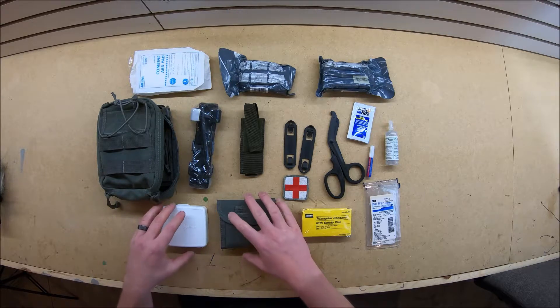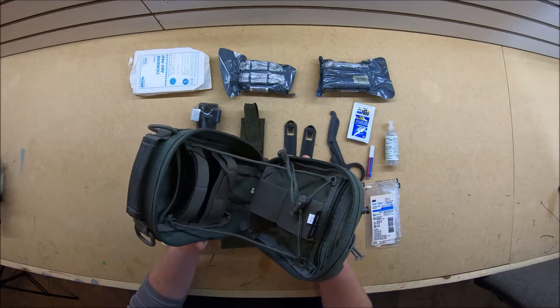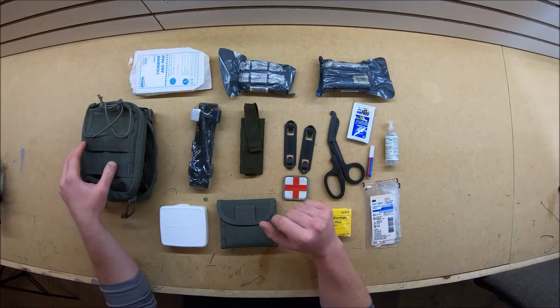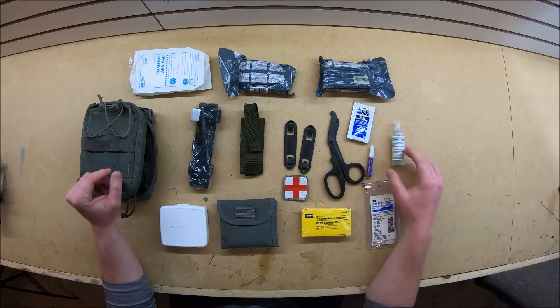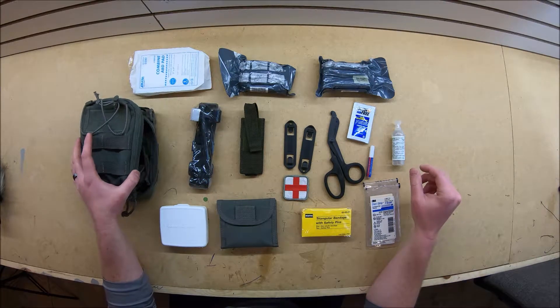We're going to start out here with this Maxpedition pouch. This is going to be the foundation of everything. This thing can hold a bunch of stuff - you can add a bunch of stuff onto it. This is by no means a comprehensive list. I've used some stuff out of here I need to replace, and I've just been developing and building this over the course of time for stuff that I like to use.